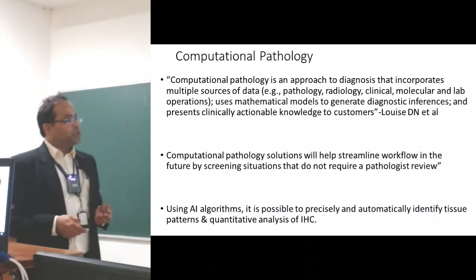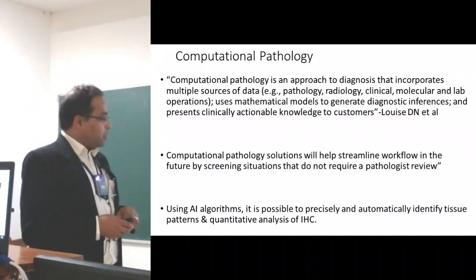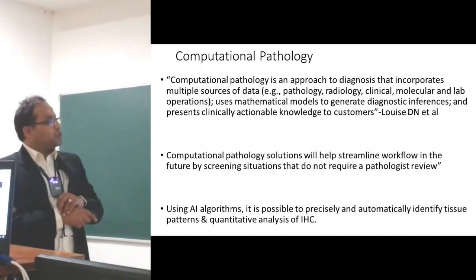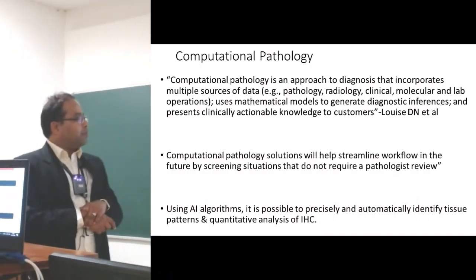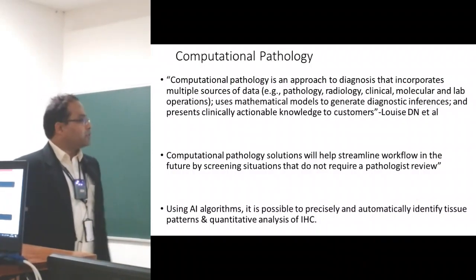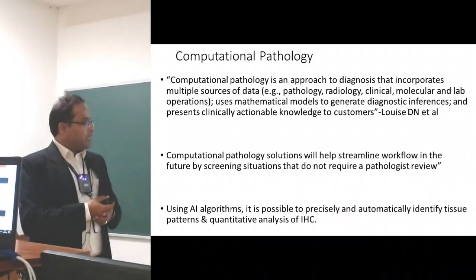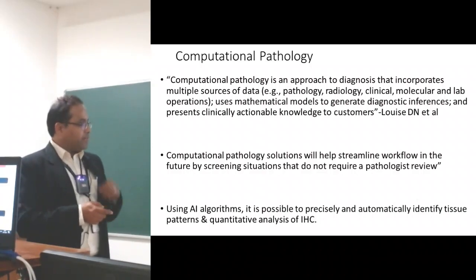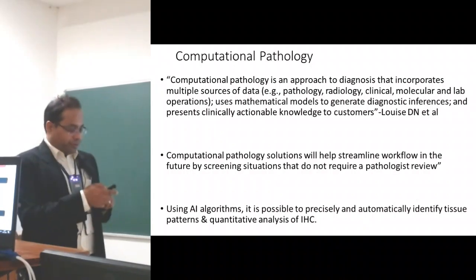Next we come to computational pathology. I'll just touch upon it. My colleague Dr. Paramita will dwell on it. So it is an approach to diagnosis that incorporates multiple sources of data, for example from pathology, radiology, clinical, molecular and lab operations, and uses mathematical models to generate diagnostic inferences and presents clinically actionable knowledge to customers. It will enable us to streamline workflow in future by screening situations that do not require a pathologist review.